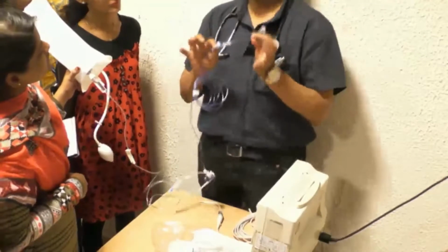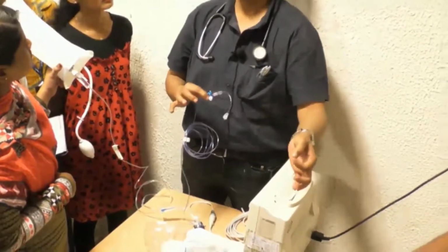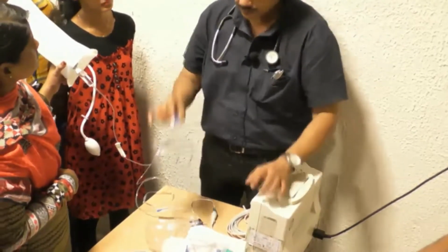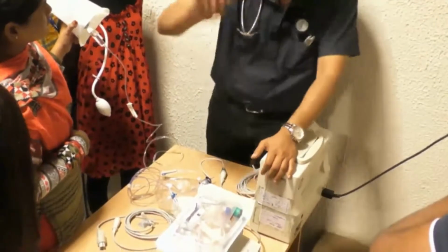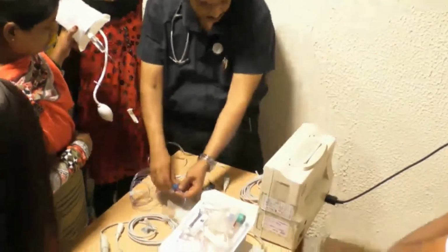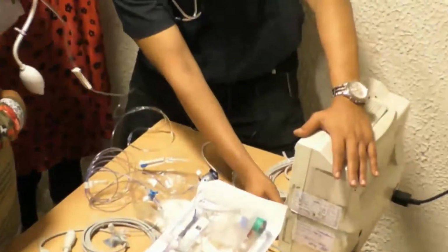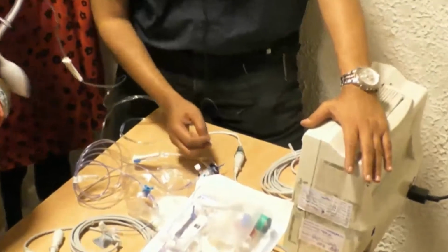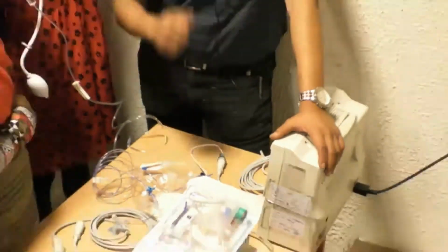Only pressure at the tip of the catheter, the patient's arterial blood pressure, right? So now after that, you can see it here and open it to the atmosphere. The pressure reads 0. I see the channel where it is done, and if it was attached to a patient, it would have given the zeroing down. How many times do you zero it?